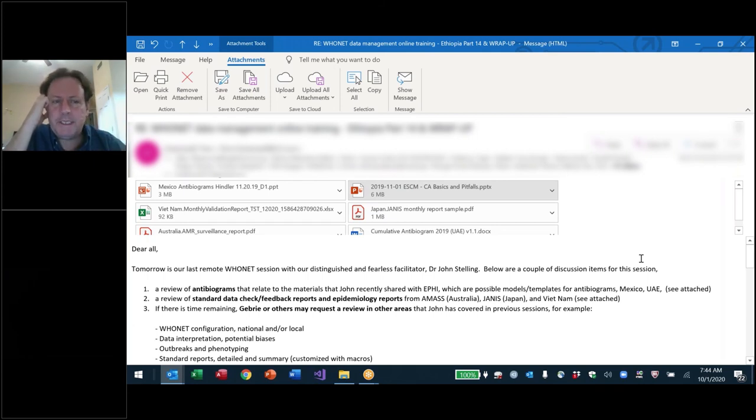So there are many cases where it's easy. This is hospital infection, this is community infection. But there are a lot of patients in the middle where it really is not clear. Patient was exposed to the hospital, but they did not have high risk exposure.